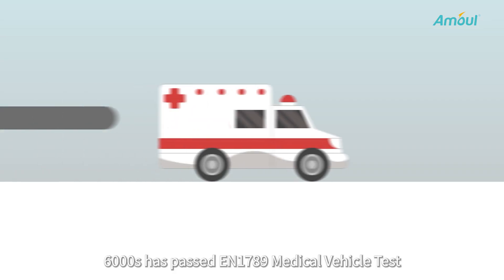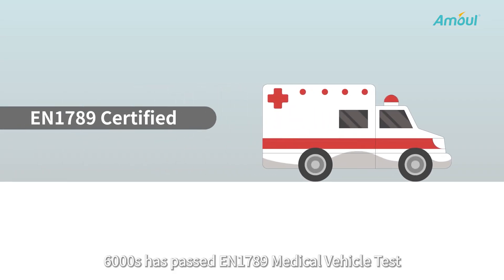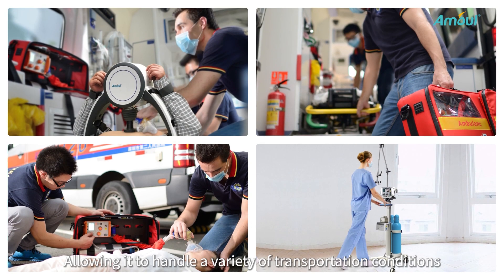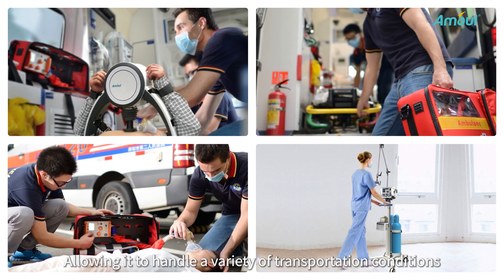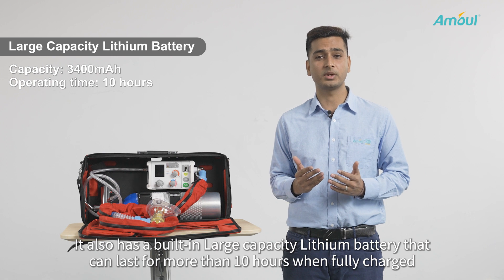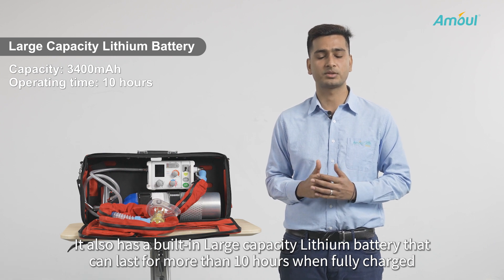The 6000S has passed the EN 1789 medical vehicle test and has great drop and shock resistance, allowing it to handle a variety of complicated transportation conditions. It also has a built-in large capacity lithium battery that can last for more than 10 hours when fully charged.